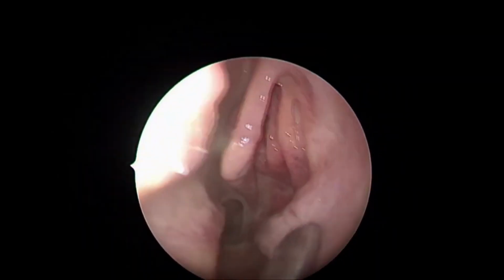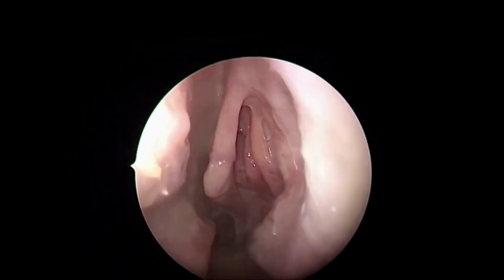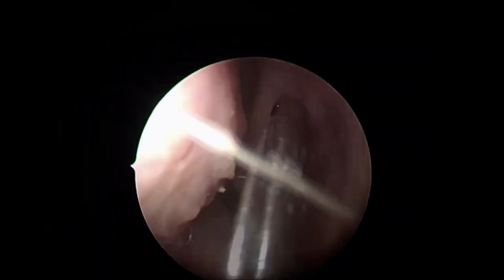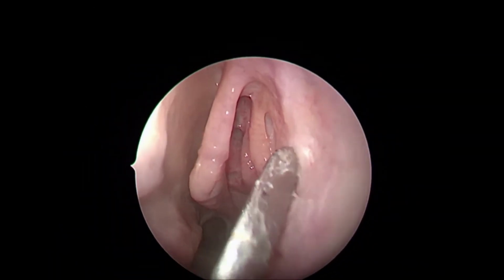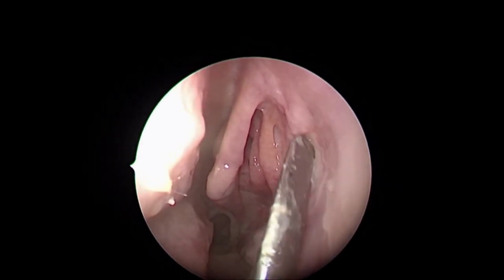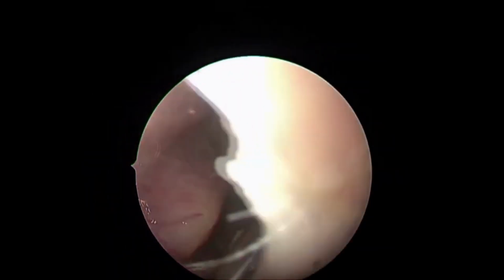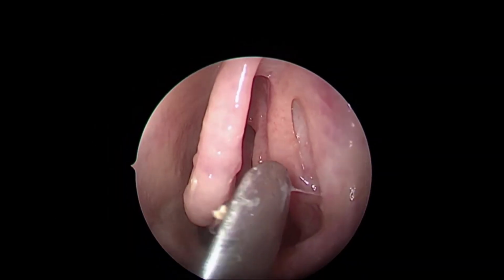Now, coming from this inferior meatus above, this is a flat area in the medial wall of the maxilla, or the lateral wall of the nose, with relatively no neurovascular structures over here, known as the atrium. And behind are the important areas where the protuberance starts. The first protuberance belongs again to the nasolacrimal duct, which comes from above and opens here in the inferior meatus, which we have seen just now. Behind this protuberance is another protuberance.